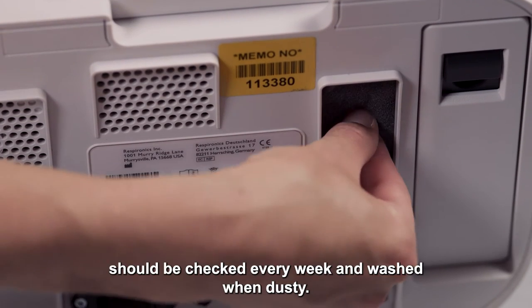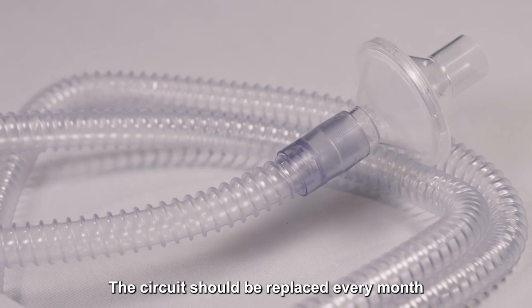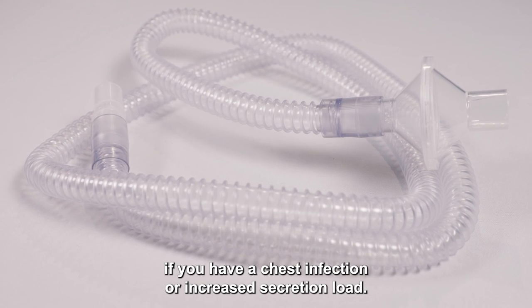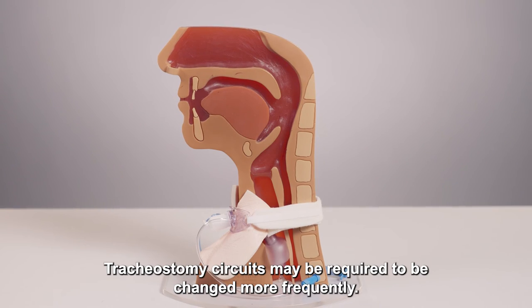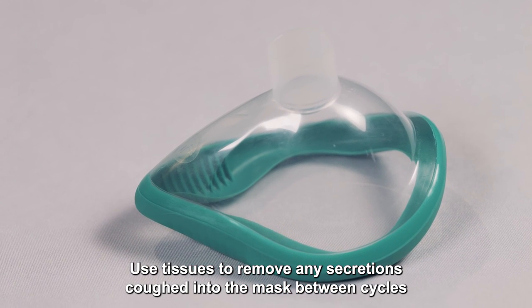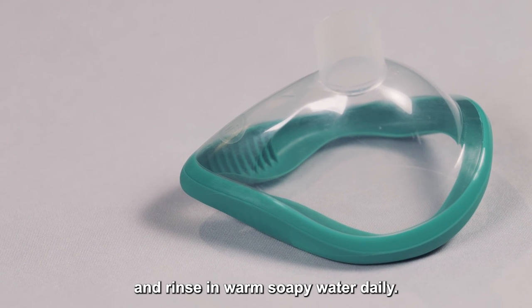The grey dust filter should be checked every week and washed when dusty. The circuit should be replaced every month to prevent growth of bacteria, and more frequently if you have a chest infection or increased secretion load. Tracheostomy circuits may be required to be changed more frequently. Use tissues to remove any secretions coughed into the mask between cycles and rinse in warm soapy water daily.